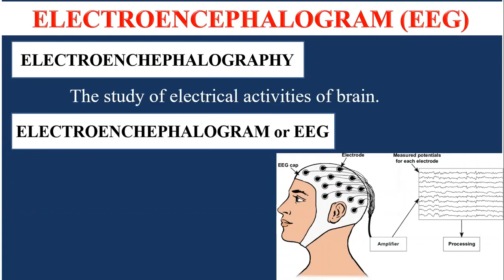The study of the brain is a complicated process as compared to a single nerve fiber, as the brain is made up of different nerve cells, and these are neurons, and these neurons communicate with each other through nerve impulse transmission. So these neurons are involved in the conduction of nerve impulses by receiving and then transferring information. These activities of the brain are recorded by a machine known as an electroencephalogram or EEG.